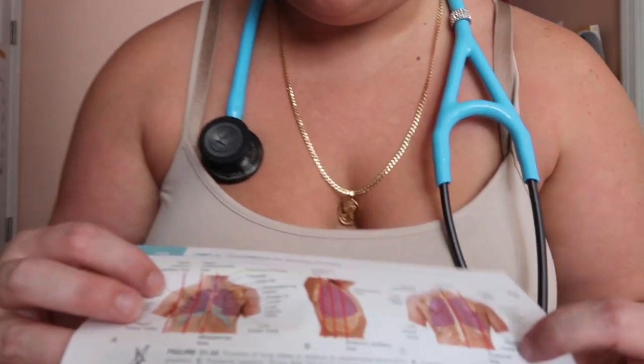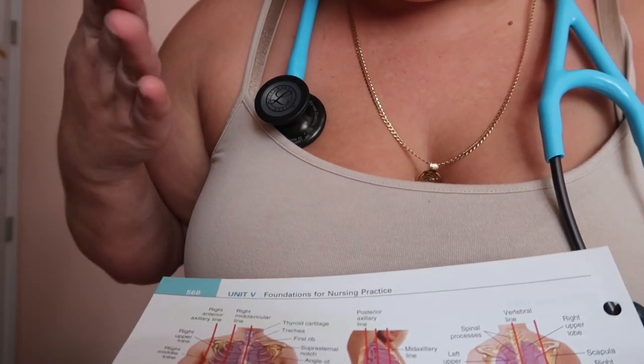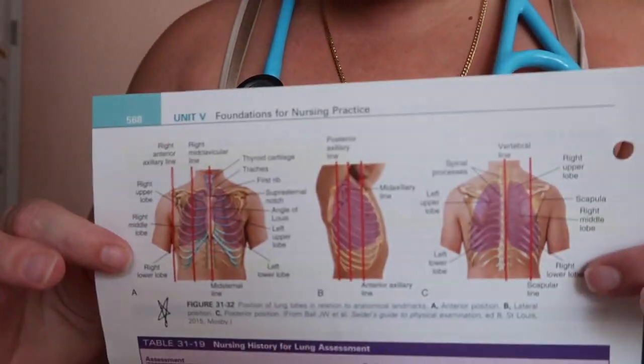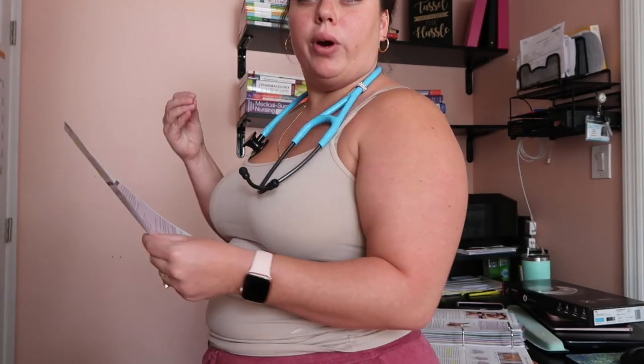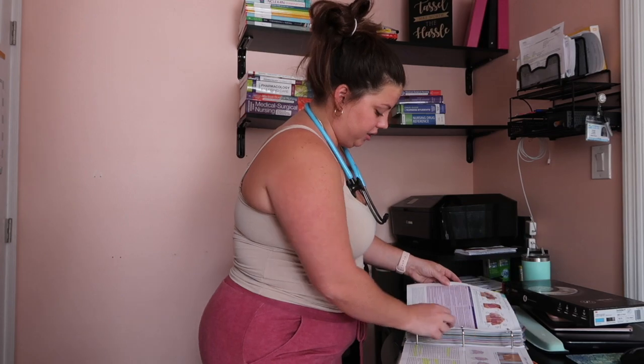These are awesome diagrams. It shows you your lungs and where your heart sits, and it gives you landmarks like the axillary line and the mid-clavicular line — just showing you where you're going to be listening. I really like this diagram. If you like it, pause the video and screenshot it — I studied it constantly.